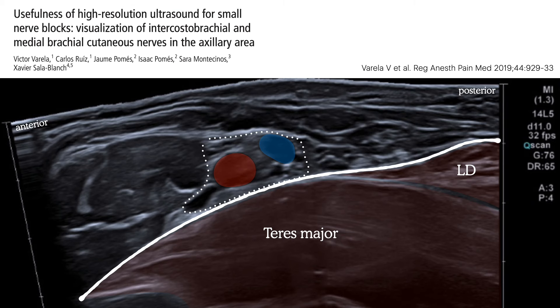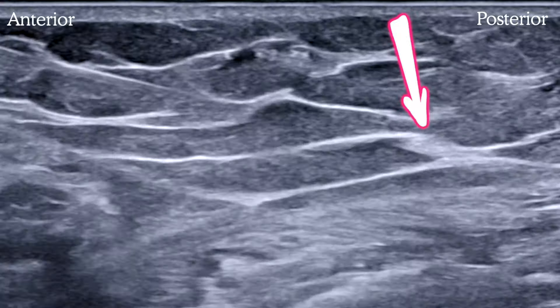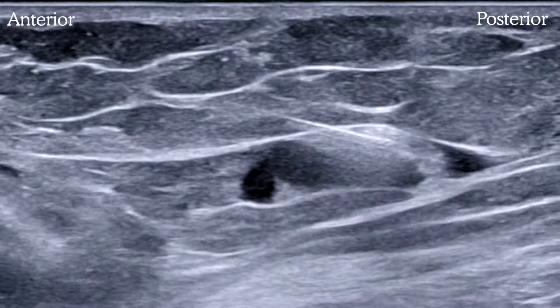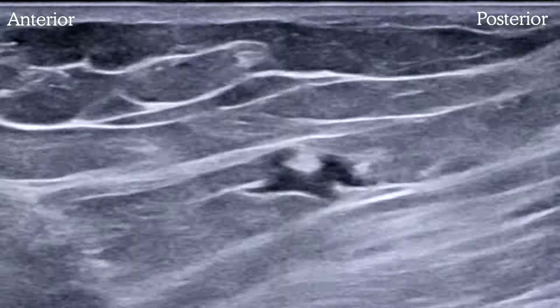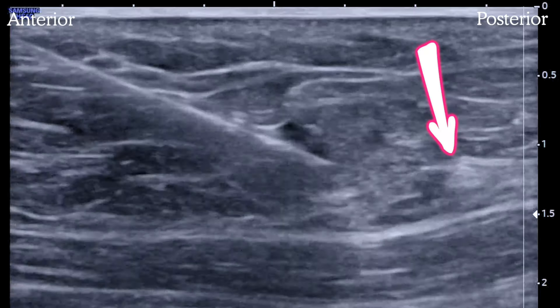It is possible to see the nerves in many patients. Here are two branches of the intercostal brachial lying just where we'd expect them — over the conjoint tendon. To do this block, we place the probe in the axilla over the artery and slide it down toward the bed to image the subcutaneous space over lat dorsi and teres major. The needle comes in-plane from the anterior aspect. The nerves look like little hyperechoic raspberries lying just on top of the fascia.